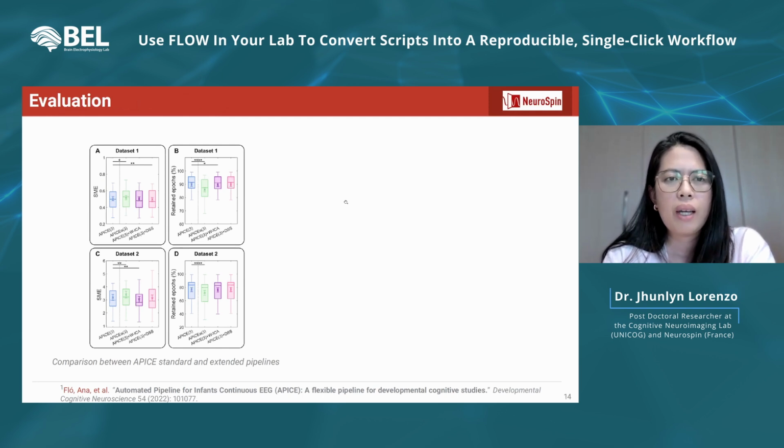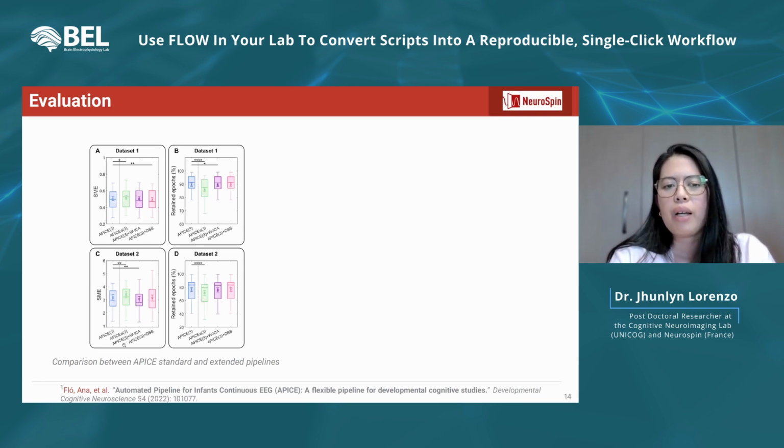APICE was evaluated using two different data sets. The first data set is a data set with neonates with an audio task, and the second data set is with 5 months old doing some visual experiments. So we compared here APICE with the extended pipelines, or APICE plus additional reconstruction algorithms.